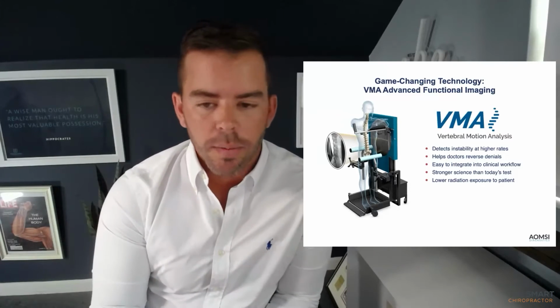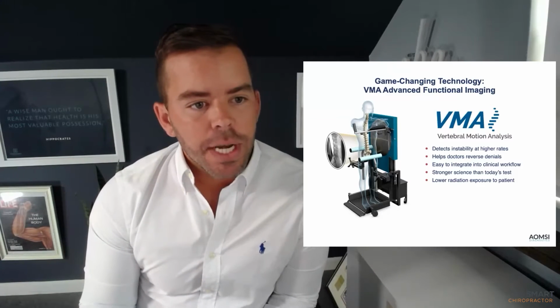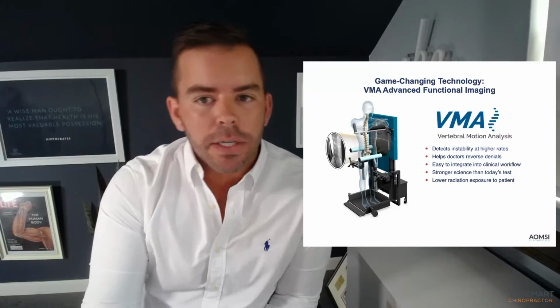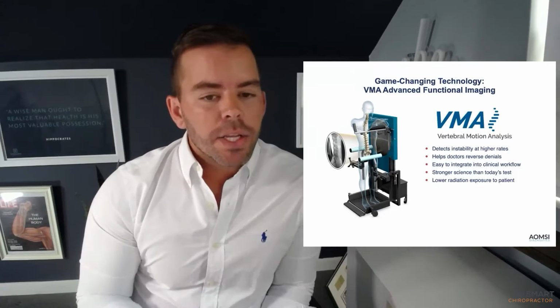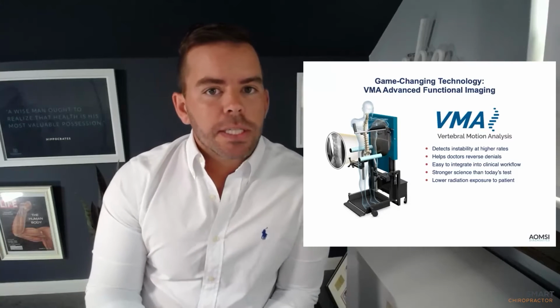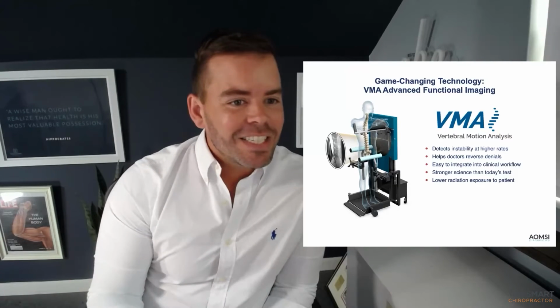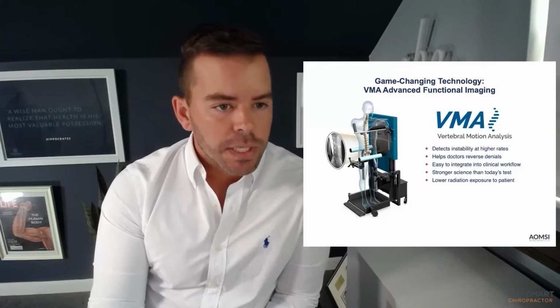So really, as we talk about today's test that we're comparing to, it's going to be the flexion extension X-ray. So again, that particular data goes back into the 1940s, right? And so as we talk about flexion extension, there's really a gap that takes place. Flexion extension is great, and X-rays are great at determining what's going on in the particular spine. But really, if we think about the flexion extension X-ray, it's a flexion, it's an extension, and it's a neutral image, and from our standpoint, what happens in between? That's a big gap from the functional side.